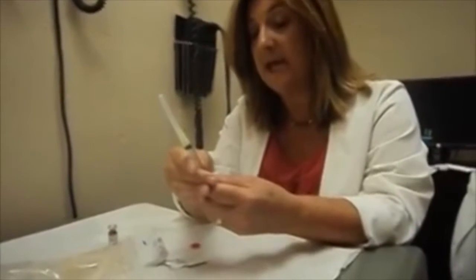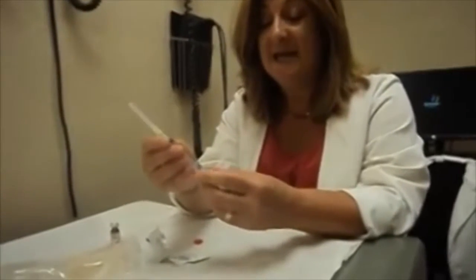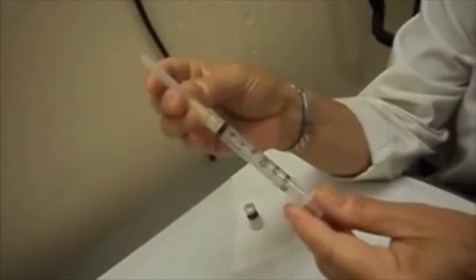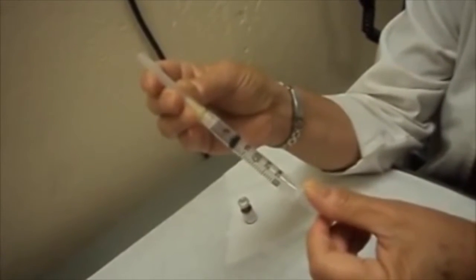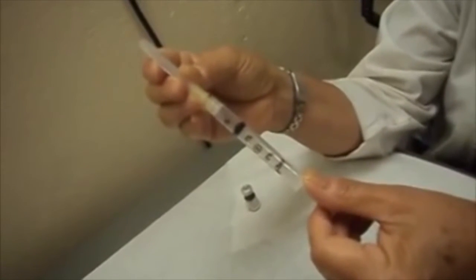Let's get familiar with the syringe a little bit. When you're going to draw up your dose, the doctor will tell you how much you're going to be taking. In vitamin B12, it's usually 1,000 micrograms, and in medical talk, this will translate to 1 cc. As you can see on the syringe, the markings are pretty clear, and what you want to do is pull the plunger back to the line that's closest to the needle with your dose.